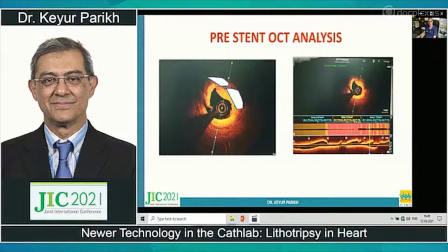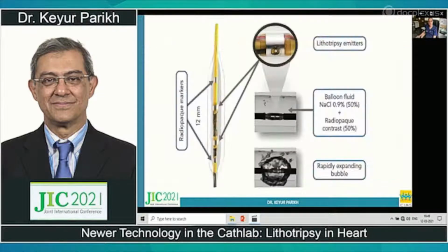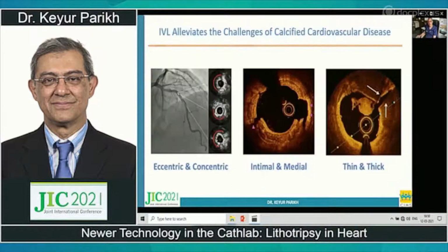This is another residual calcium. And this is again, as you see, the pre-COVID era, last January. And these are the lithotripsy emitters, which emit waves using a rapidly expanding bubble. The high-speed sonic pressure wave created inside the balloon and into the artery opens the lesion.